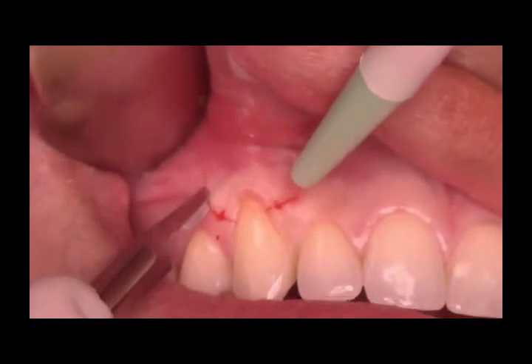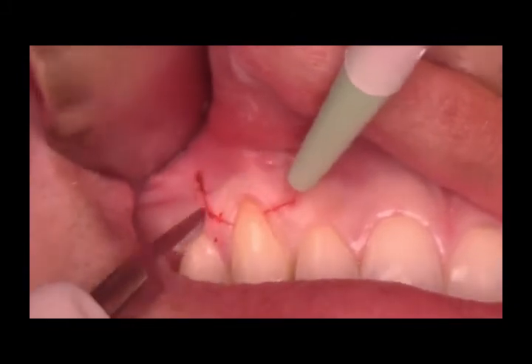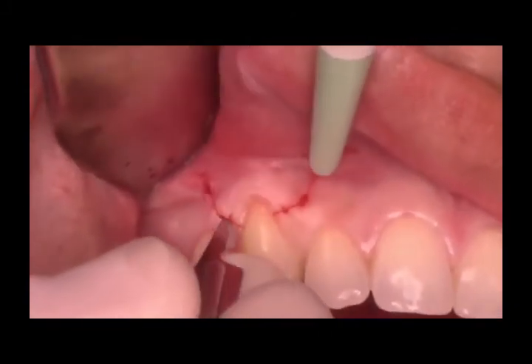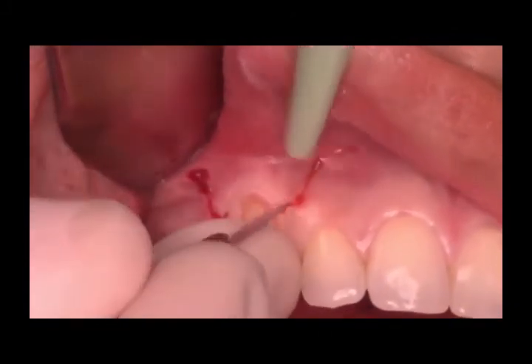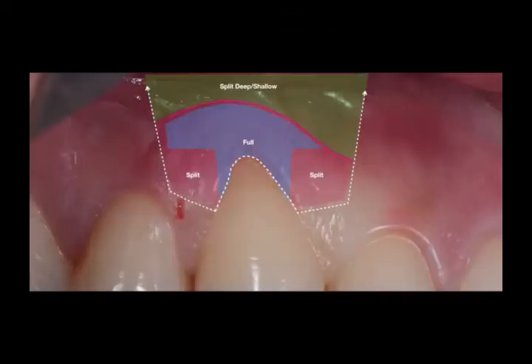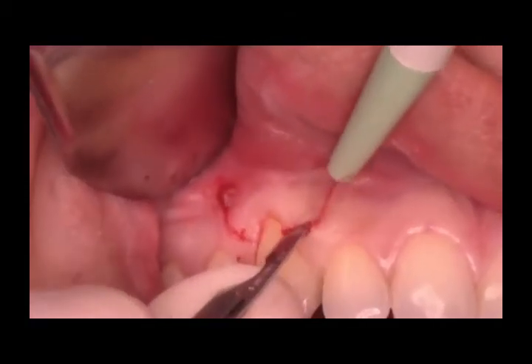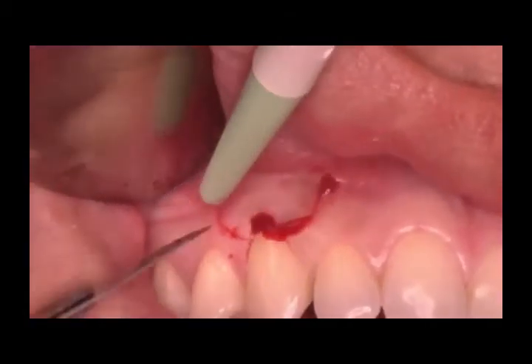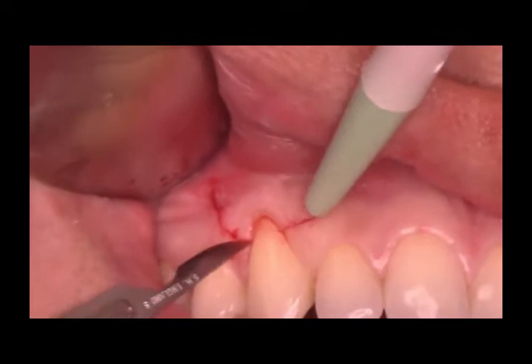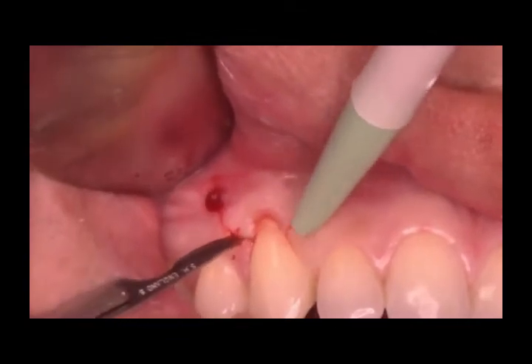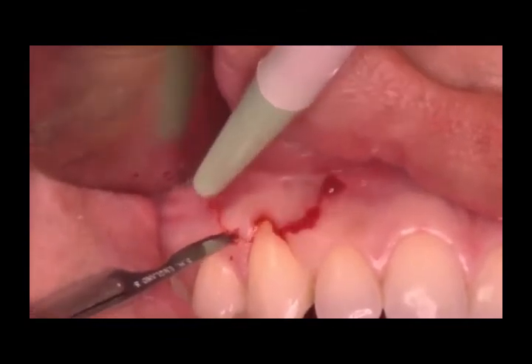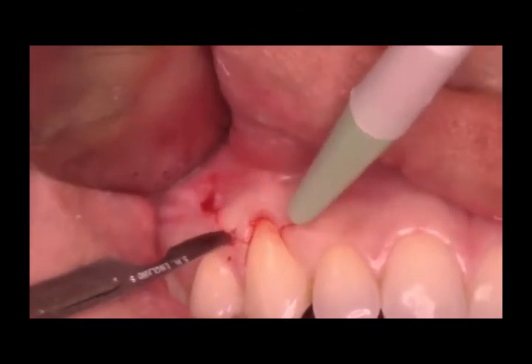This video explains the coronally advanced flap used to treat gingival recession along with the use of a connective tissue graft. Incisions are being placed with the help of a Bard Parker blade. Horizontal, sulcular, and vertical releasing incisions have been given, and a mucoperiosteal flap will be raised.